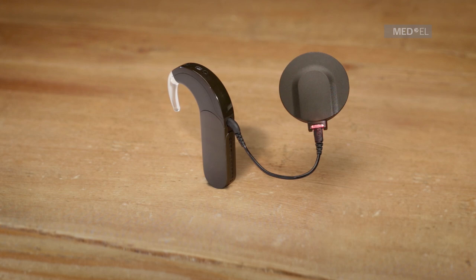Continuous short red blinks indicate the DL coil is not communicating with the implant. Ensure the DL coil is positioned over the correct implant. If the problem persists, try replacing the coil cable. Short red blinks 10 seconds apart indicate the DL coil has powered off. Turn your Sonnet off and back on and reposition the DL coil over the implant.